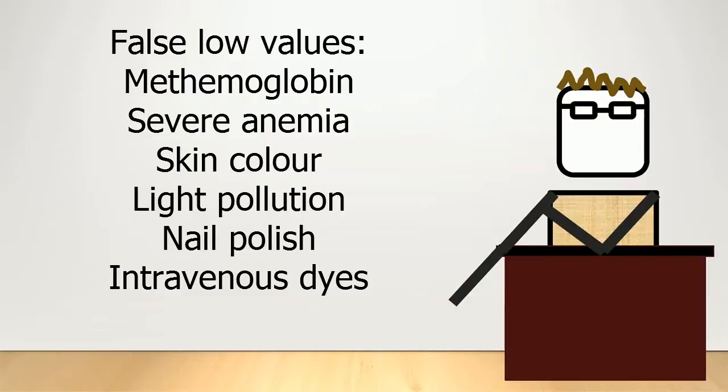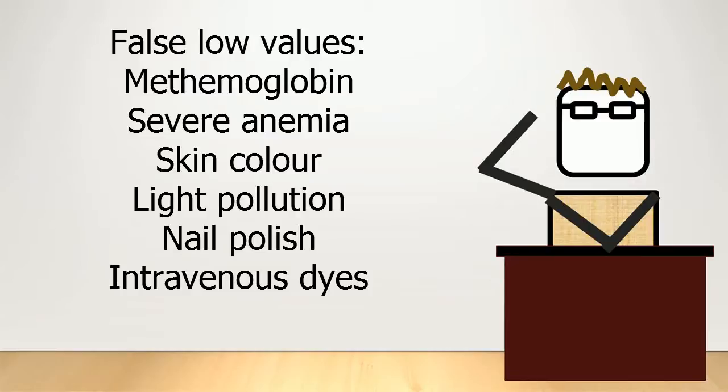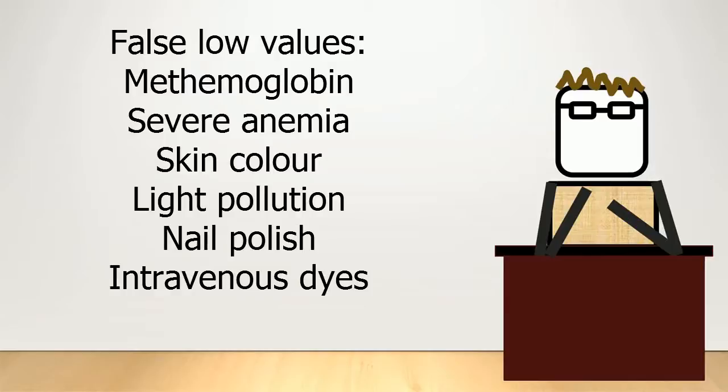The clue is that the patient is cyanotic, and when you measure the PaO2, it's actually high. Recall that the PaO2 is a measurement of the oxygen that's dissolved in the blood and not bound to hemoglobin. When you compare the PaO2 and you see that there's a low oxygen saturation, you need to be suspicious that there's something off, because when the PaO2 is high, oxygen saturation should be 100%.